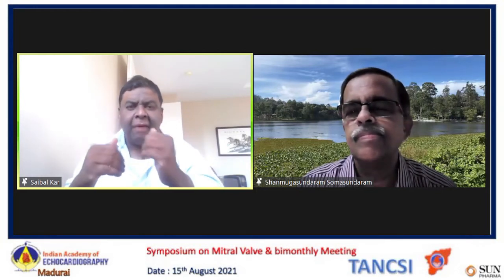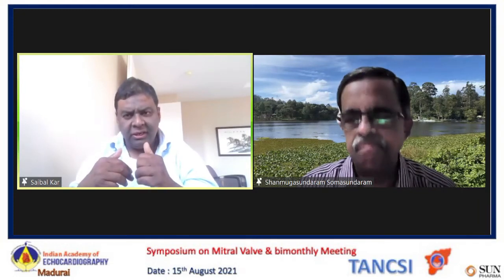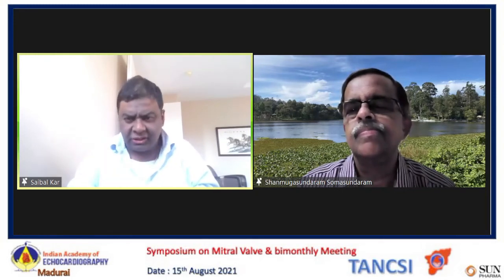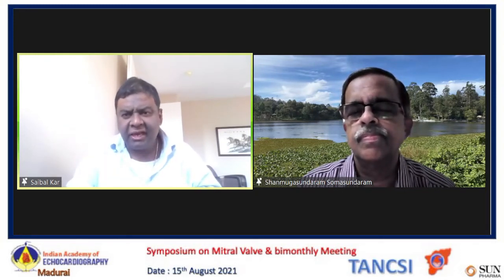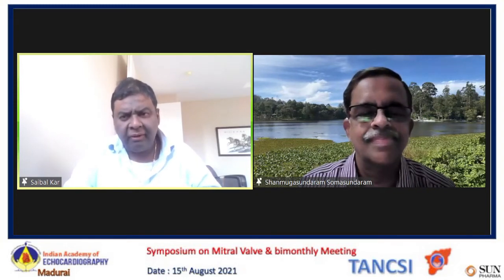Usually, if you have a gap of more than 6-7 millimeters, it is difficult to grasp the leaflets. Above 7 millimeters, the clip arms will not be able to catch it. But less than 7 millimeters, the gap is okay. Also, the important thing is the mitral valve area.